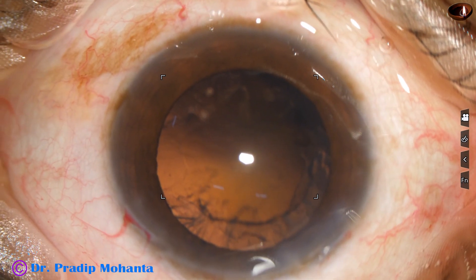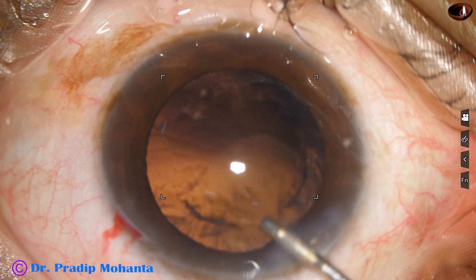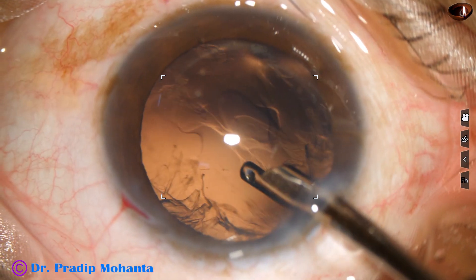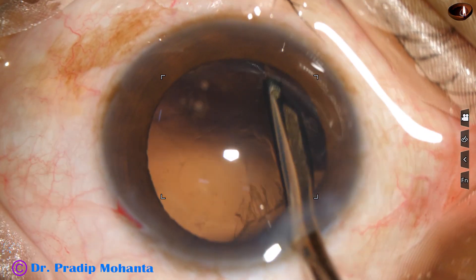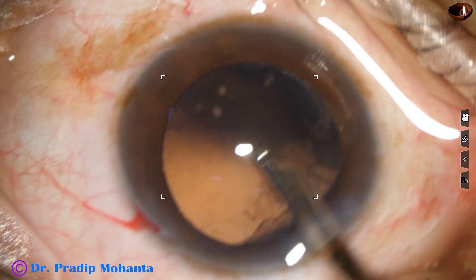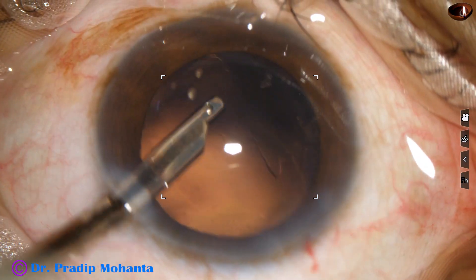This kind of cataract, where the lens fibers are sticky, where we cannot chop the nucleus into two pieces, where even stop-and-chop technique is difficult — this pre-chopper helps a lot. And this is an unedited recording, and you could see that in a very short time we could manage the nucleus.